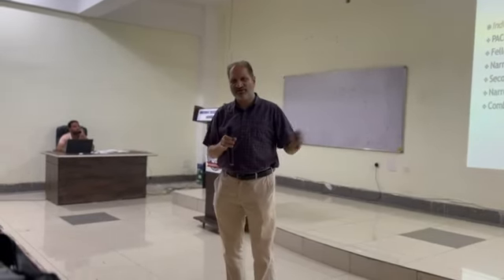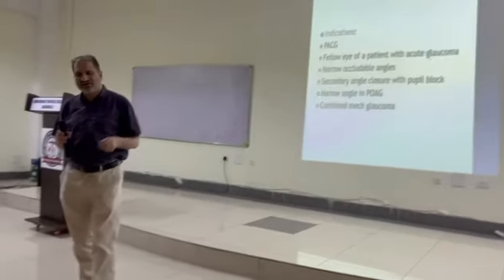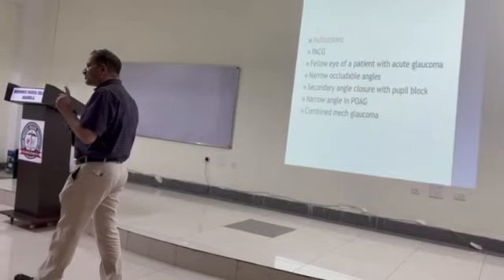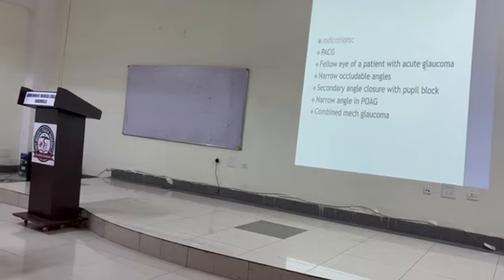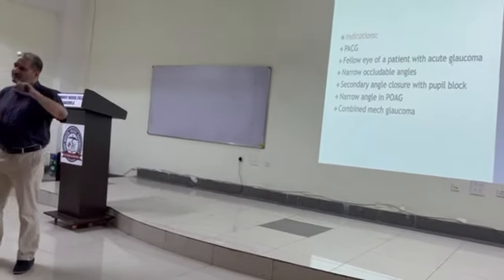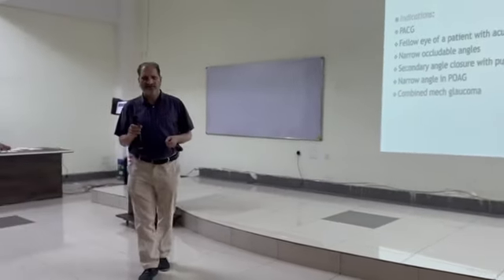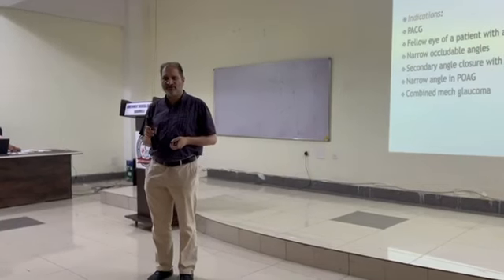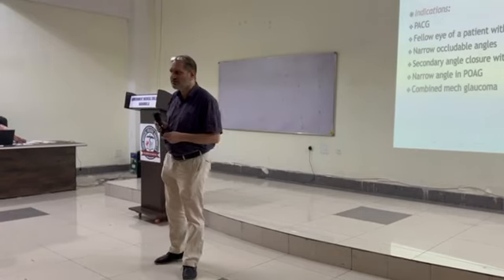But now the trend is laser iridotomy. What are the indications of this iridotomy? Angle closure glaucoma is the most important indication for iridotomy, whether it is primary angle closure glaucoma or another presentation. If there is an angle closure attack in one eye, then you treat the other eye to avoid that attack of closure in that eye. Then occludable angles. What are occludable angles?